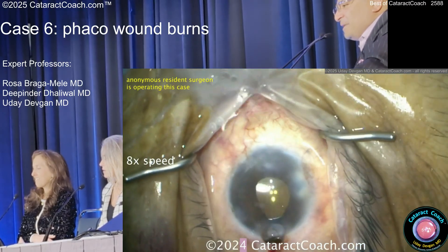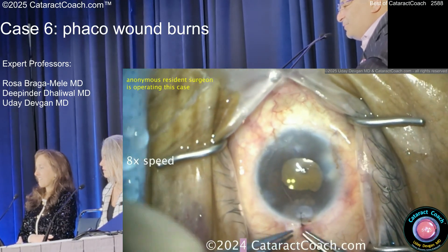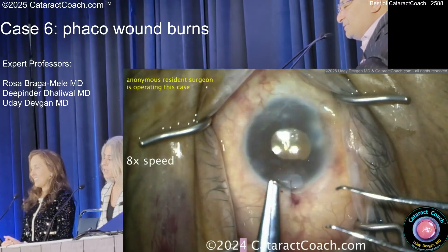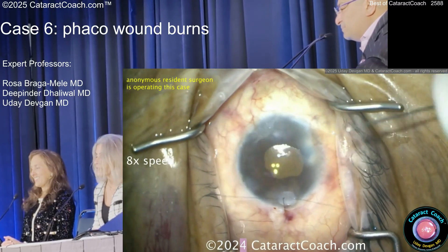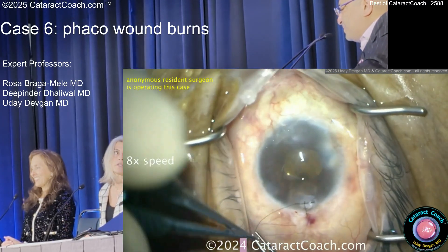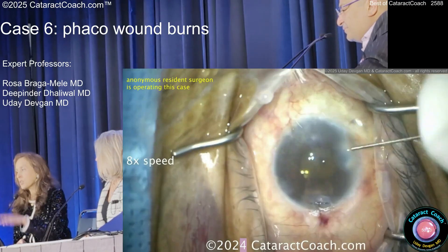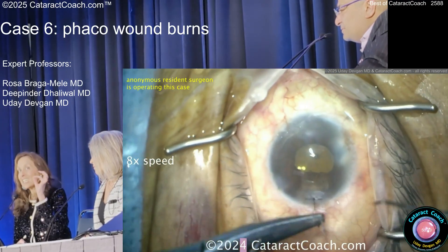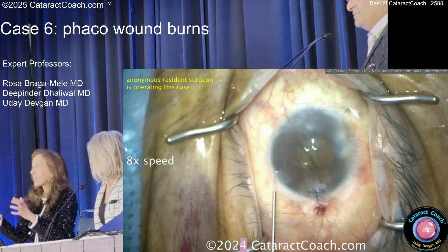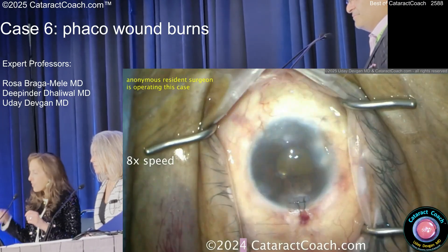The good news is, believe it or not, these patients can do okay — but you're looking at leaving sutures in for months, and the cornea slowly going back to reasonable after a year. There is new technology available that will help prevent wound burns. Before you step on the pedal to position three to get FACO, make sure you're not hearing a ding-ding-ding — that means it's occluded already. Go in, just irrigate and aspirate, see what's happening, and as long as you've established flow, then start FACO.